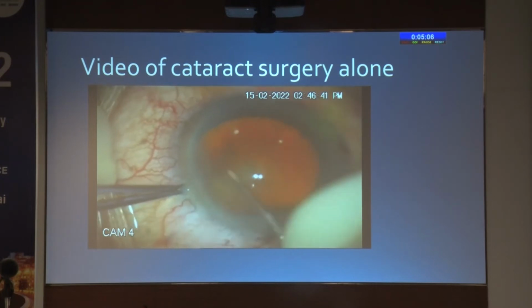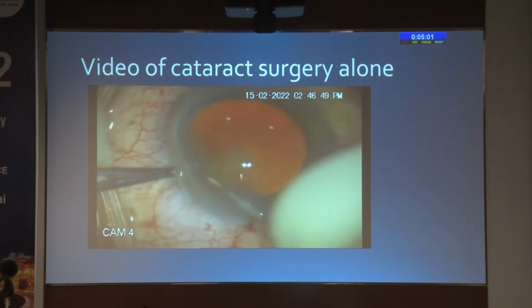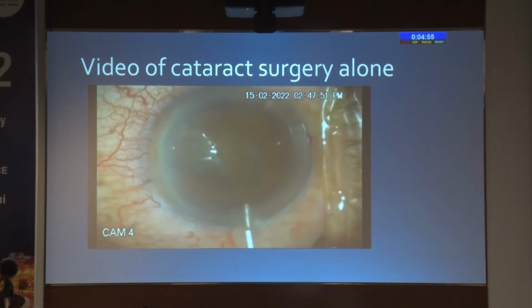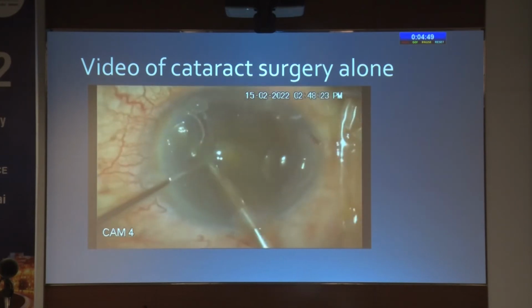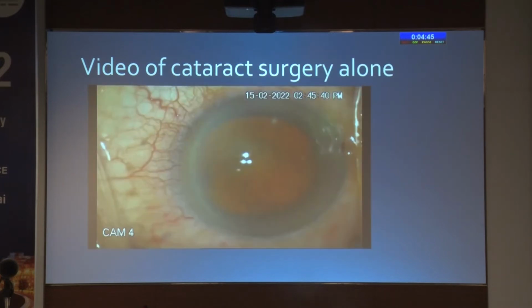So certain tips we should keep in mind while doing cataract surgery in such patients: sharp instruments should be minimally used. We should avoid contact of instruments with the corneal endothelium. Anterior chamber should be adequately maintained throughout the procedure.